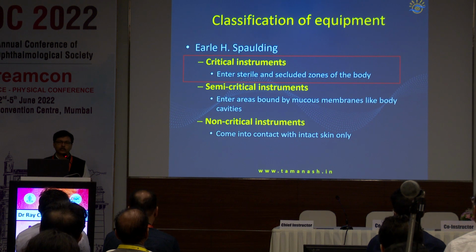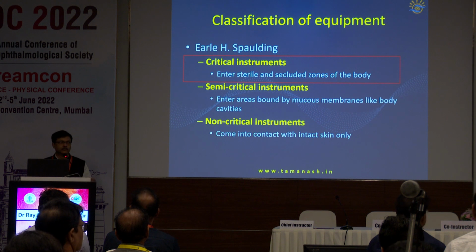And as one of my professors had taught me early, don't ever touch the business end of the instrument. So whenever you are handling the instrument, it is important that you don't touch the tip of the forceps or you don't touch the tip of your iris spatula. It should be handle-to-handle transfer.